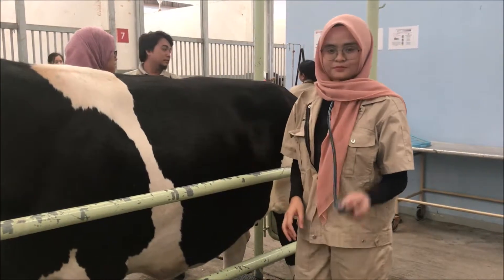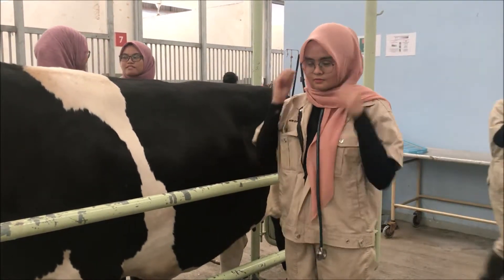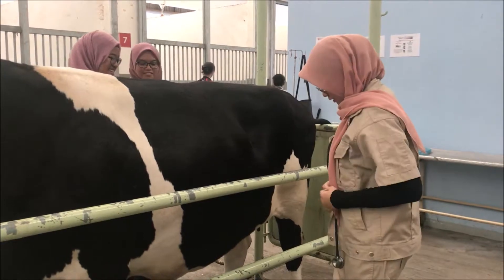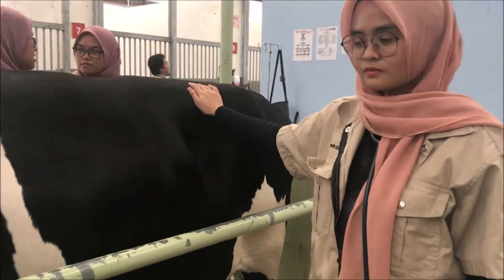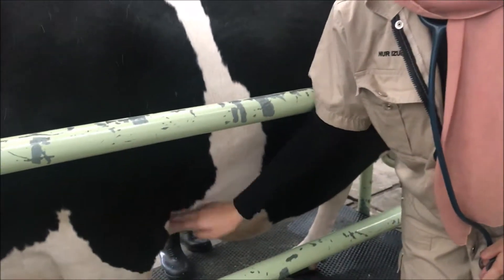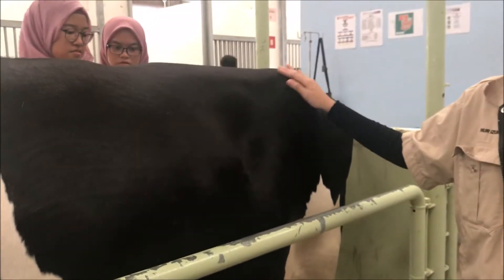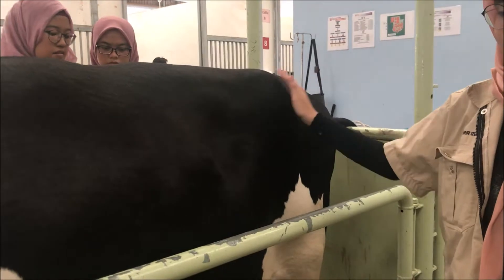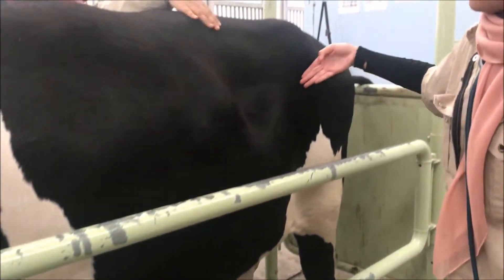Today I'm going to demonstrate the percussion and auscultation technique on bovine species. Before we start, we need to locate the landmark region for this technique. The landmark region is from the point of elbow of the cattle to the wing of ilium. Besides that, the lower abdomen region is also included.